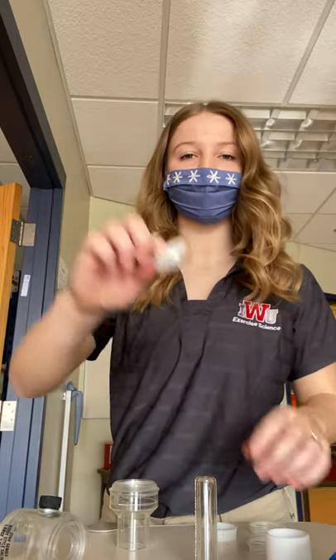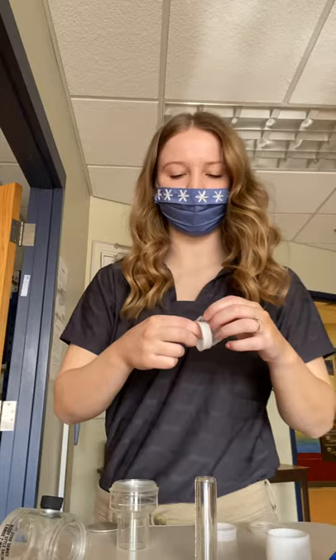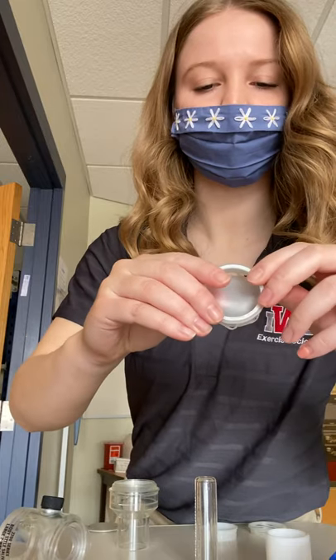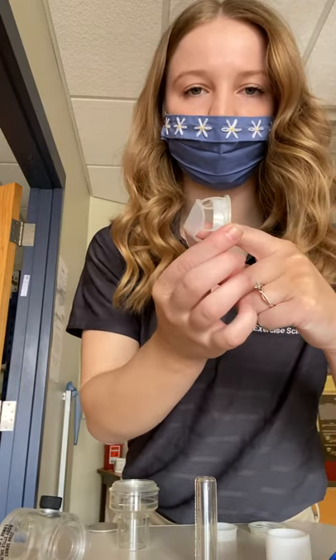All right, now you're going to get your support rings and your one-way valves and you'll place them on like this. It should end up being like that, able to let the air pass through the chamber. Do that for both of them.